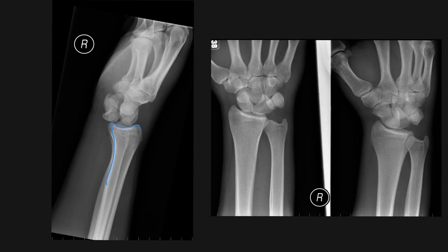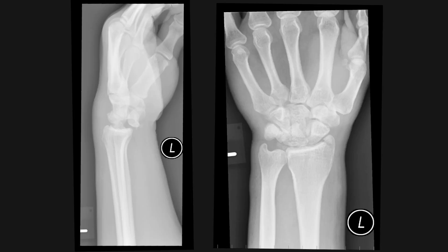Let's take a look at this third example. The distal radius is in line with the capitate, however the lunate has dislocated anteriorly, and this is a lunate dislocation. Again on the PA and oblique views you can see a triangular shaped lunate.